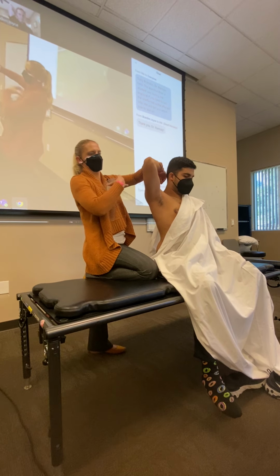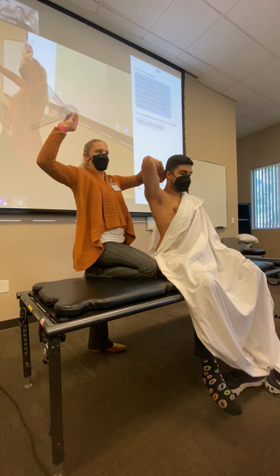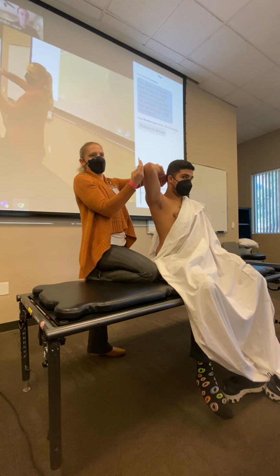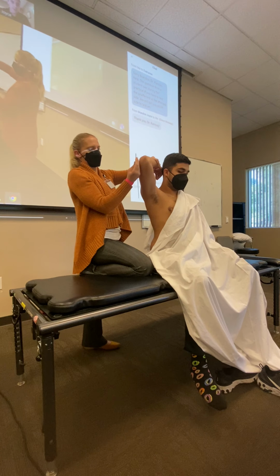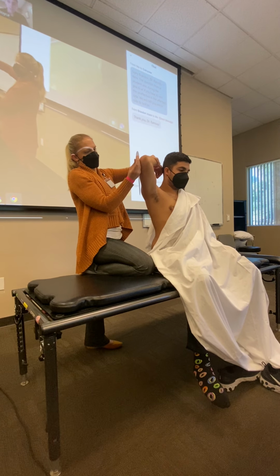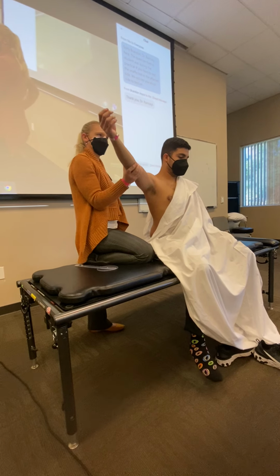Everyone good on that? I was showing some of you, I don't think I've shown the whole class. The best way to move this is to use your thumb to move the moving arm of your goni. That way your fulcrum is where it needs to be, your stabilizing arm is pointing to where it needs to be, and then you just use your thumb to make those little adjustments. And then here I have him at 114 degrees of elbow flexion.